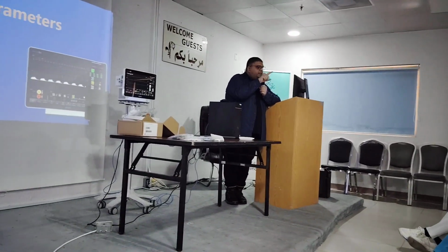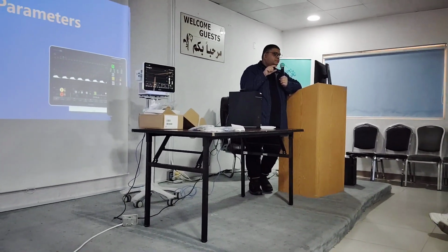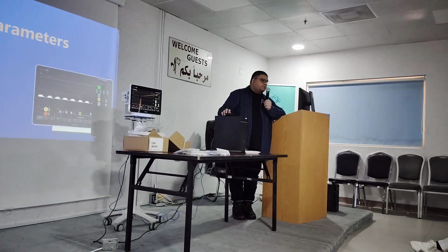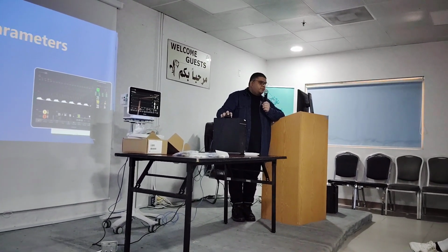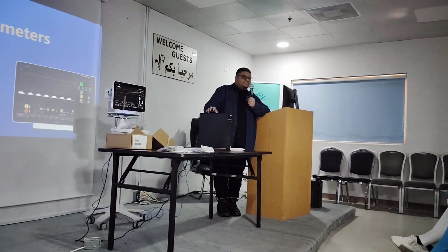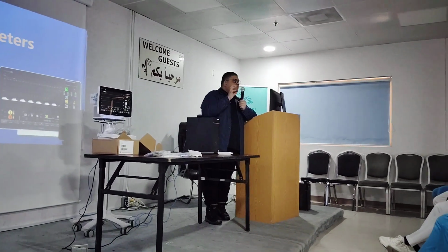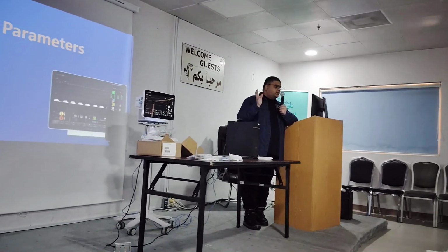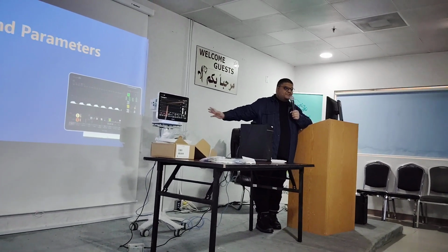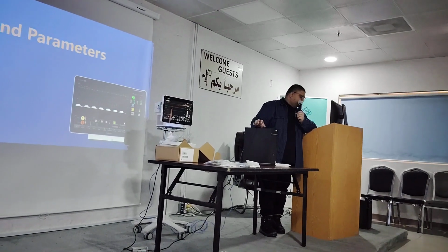So you have to click on there to be able to see the NIBP or blood pressure. It is because the screen size or the resolution of your screen is too low. So if you buy a bigger screen, this problem will be solved. Because we cannot change the size of the numbers. It's a regulation. We are a registered manufacturer, so we have to follow the rules. So that's why we get a bigger screen.